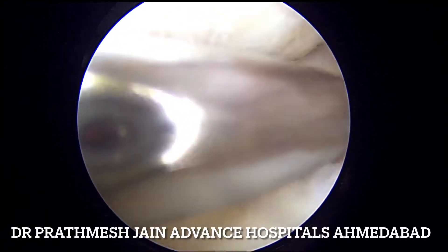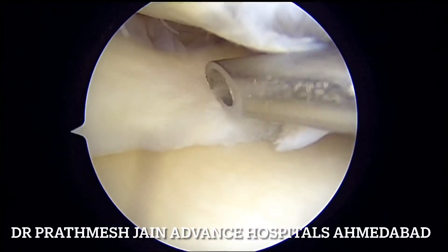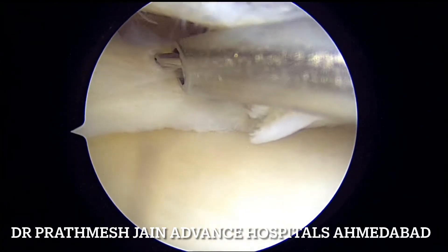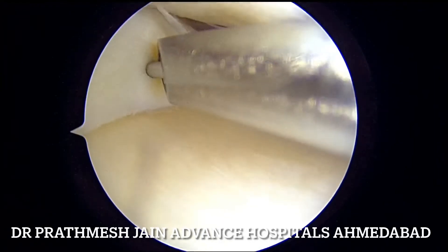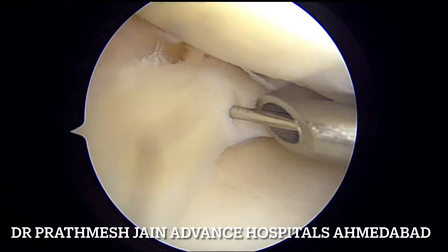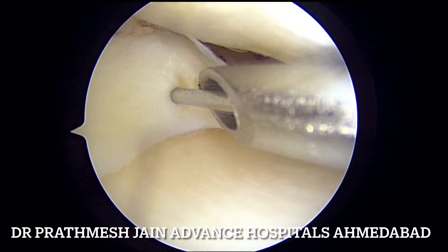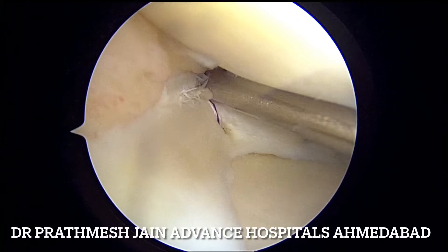The inside-out technique is usually started from the upper layer. We will be using sequential inside-out sutures — two sutures on the upper limb of the bucket handle component — and then we will be passing one more suture on the inferior component as well.